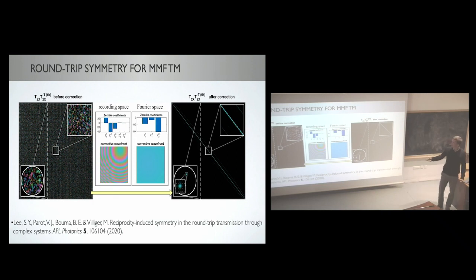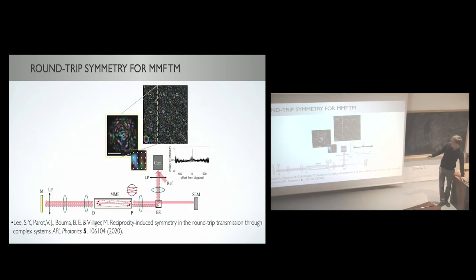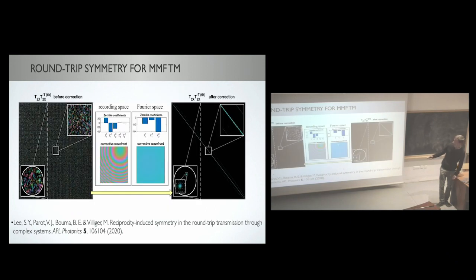Now, our goal was to convince ourselves that this transpose symmetry is indeed present. If you take the measured matrix and compute its transpose inverse, then if it is transpose symmetric, it should cancel out and give us basically an identity matrix. On first attempt, obviously, this doesn't work out because there are slight inaccuracies in the system between the illumination and detection parts, but those are optical aberrations that can be easily estimated, and then we could indeed confirm that in this larger-dimensional transmission matrix we likewise observed this clear transpose symmetry.